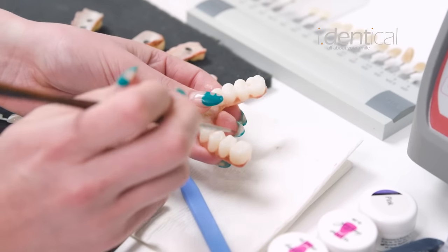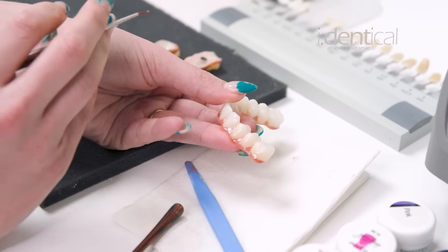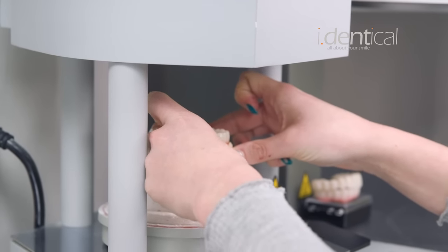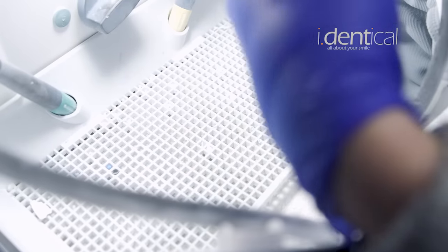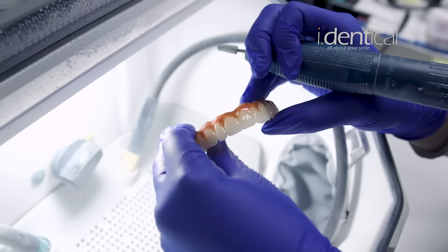I'll go through and do that to the top of the tooth, the back, and then on the other side. It will then go in our oven here and cook for about an hour. Once it comes back down, we'll be able to see how it looks and do a couple more rounds of paint to make sure it's perfect for our patient.